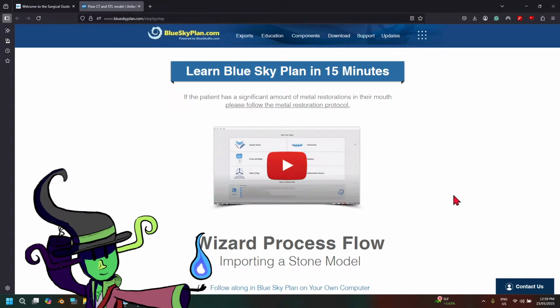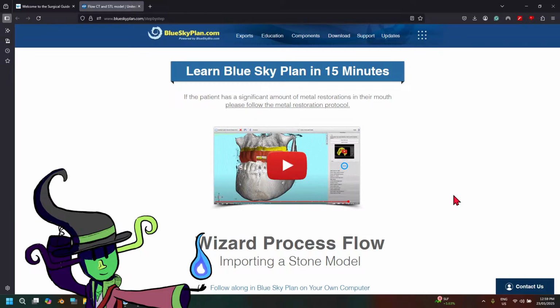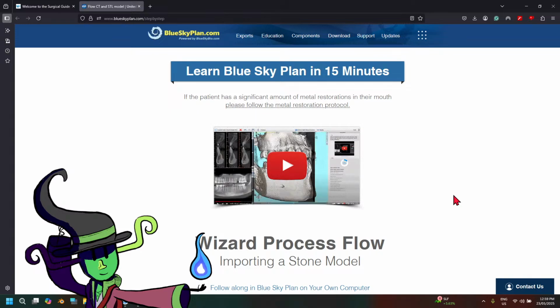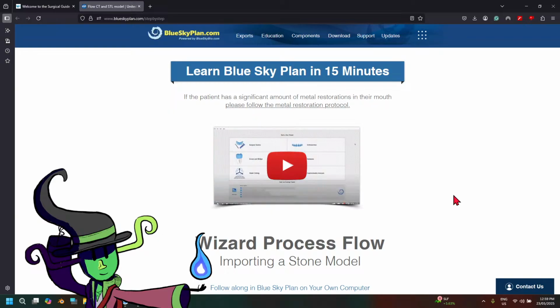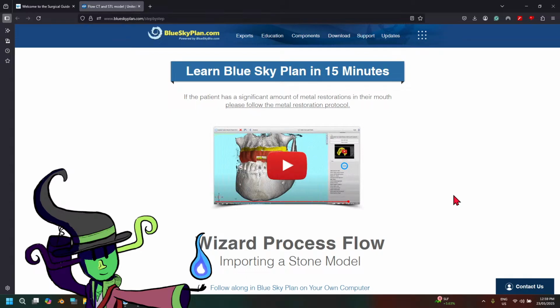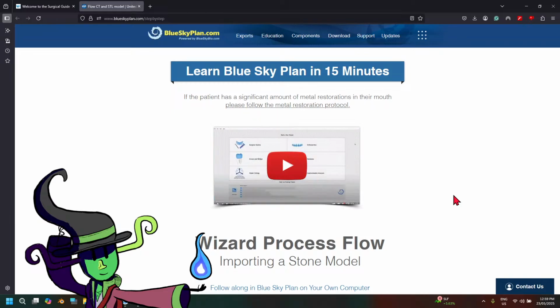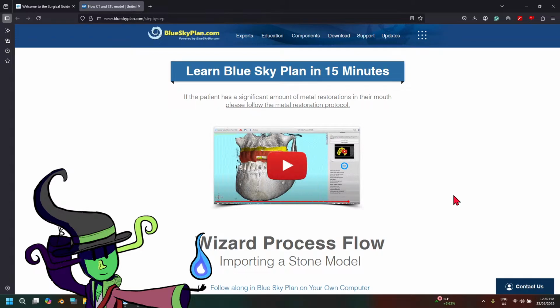It's not really new elsewhere, but it's a new trend in the country wherein dentists are now practicing a new workflow in their clinic, in which they now incorporate technology in their workplace. And the technology that they use is in this huge umbrella of this emerging field in dentistry called dental CAD, aka computer aided design / computer aided manufacturing, shortened to dental CAD CAM.